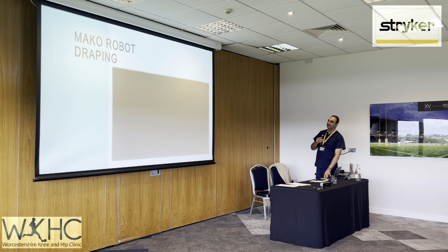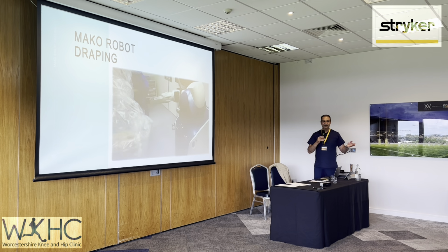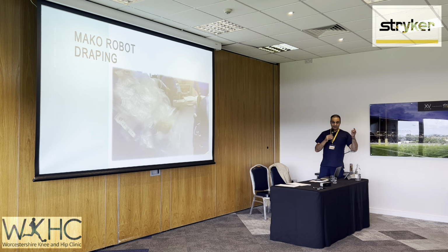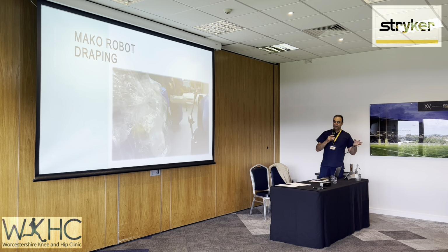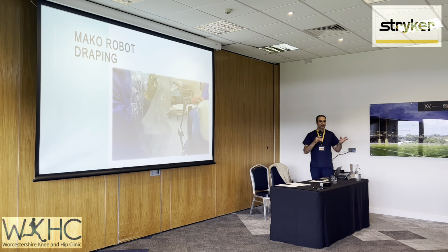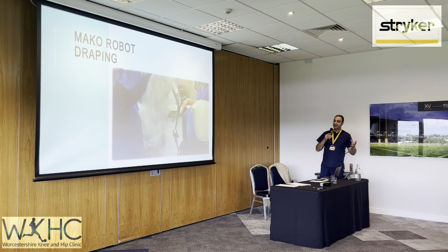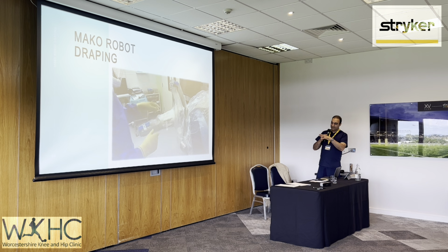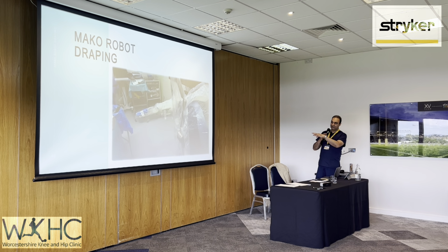Right. Okay. So the robot draping. I'm not an expert in this because I don't normally do it, but the system they teach you can be quite a complex system because you've got to cross your arms, do various things. But the faculty this afternoon will demonstrate to you how to do it with a simpler system. So you almost have to drape the robot in reverse. So the MPS pulls the sterile cover over.